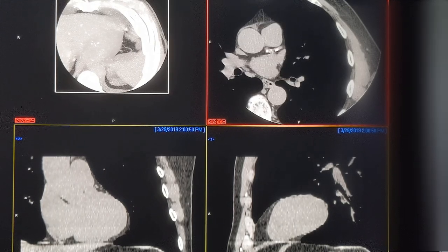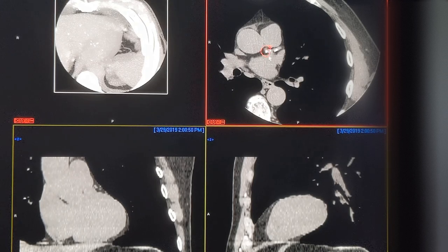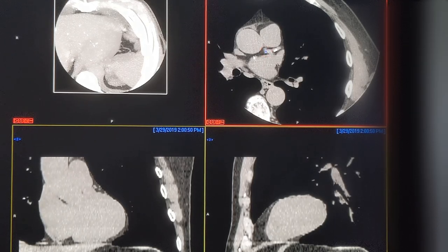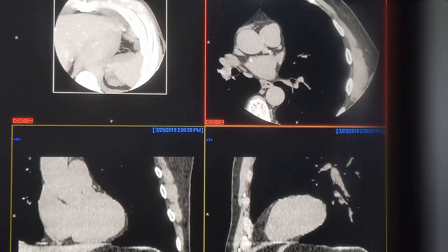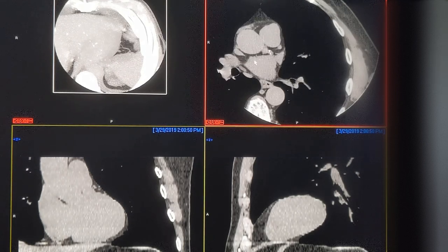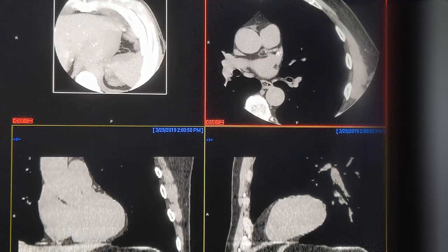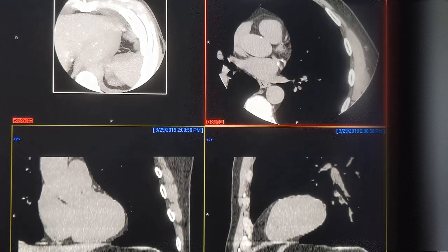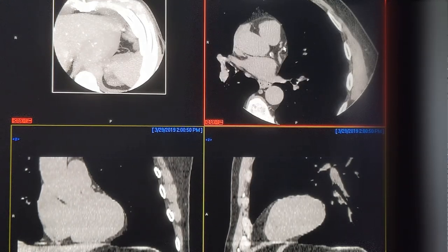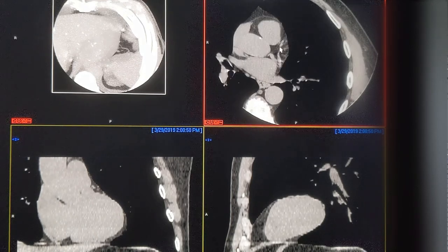I can select on my system which artery I'm working on, and then I will circle it. It will mark this — in this case blue — because this is for the left main coronary artery. As we split off here, you can see this bifurcation. This is where you get into the circumflex and the left anterior descending coronary artery, the so-called widow maker.